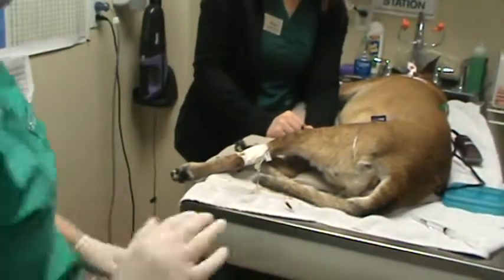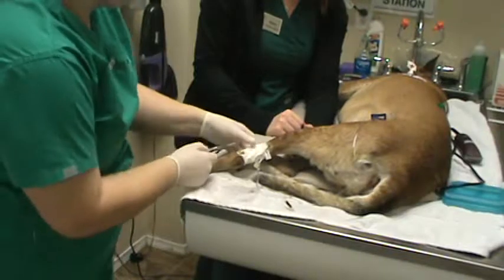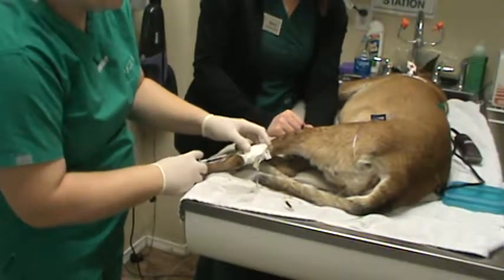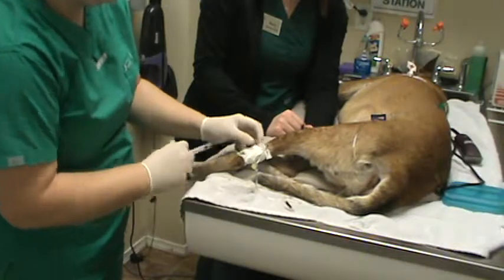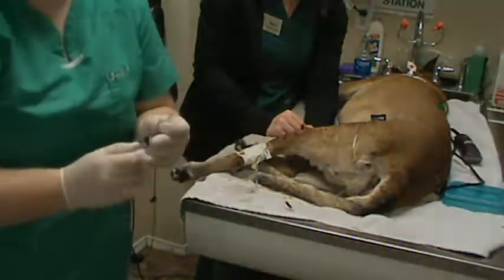Okay, and we're going to go ahead and flush that catheter and make sure it's patent. Okay, so it looks good. It's not blowing. And we can go ahead and use that catheter for induction.